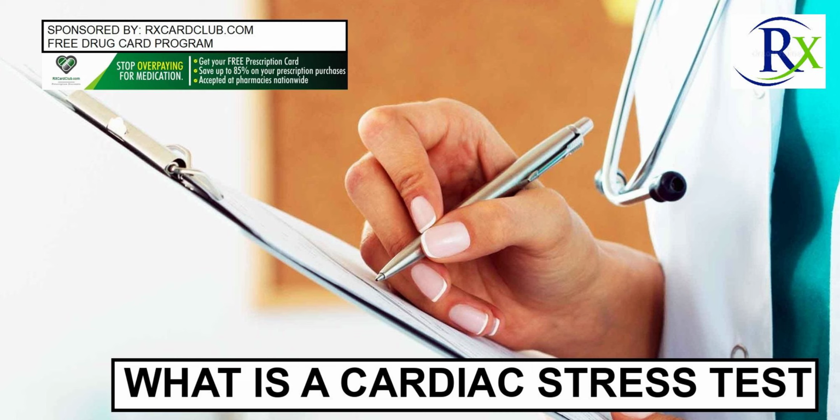What is a cardiac stress test? A cardiac stress test, also known as a cardiac exercise test, is an in-office exam used to measure the heart's response to physical exertion in a controlled environment, performed commonly on a treadmill or a stationary cycle.